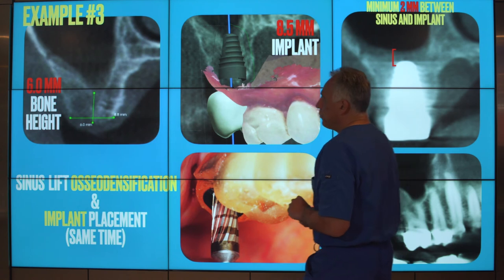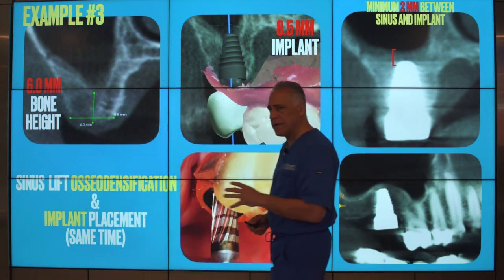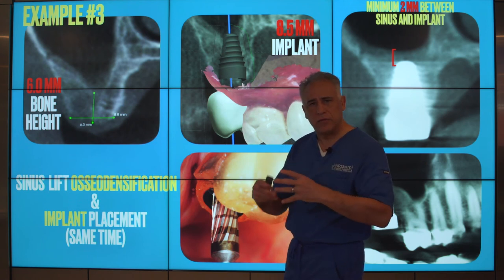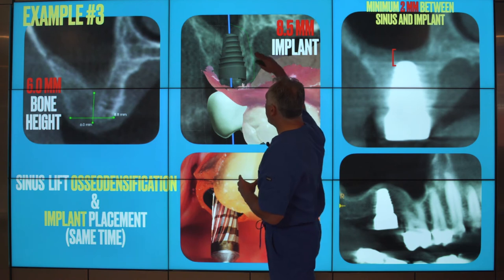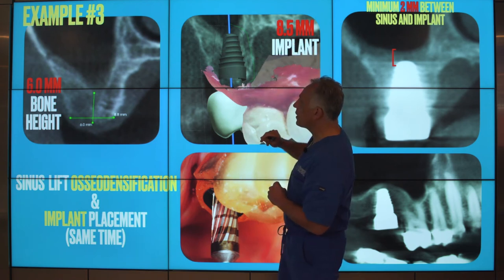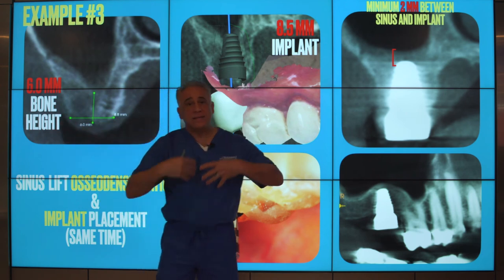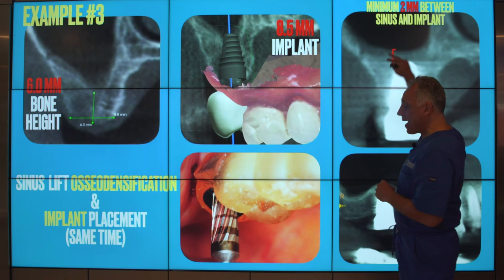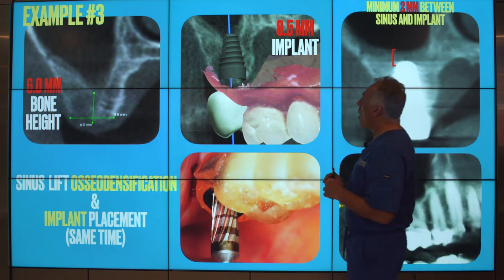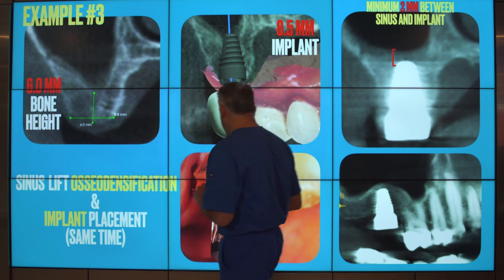The third example, a patient with a 6 millimeter height of bone, obviously slightly inadequate for the selected size implant. In this case, we have planned to place the 8.5 millimeter implant. We're about 2.5 millimeters short. If we add the other 2 millimeters of separation necessary between the implant and the sinus floor, we require about 4.5 to 5 millimeters of additional bone height.